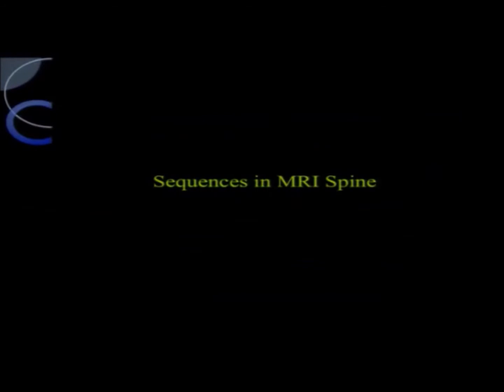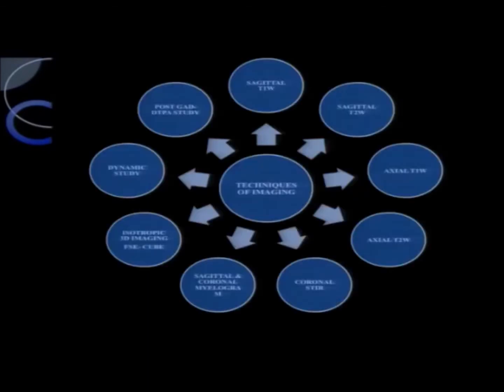The basic consensus on what should be done when we are doing MR imaging in terms of sequences is sagittal T1, sagittal T2, axial T1 and T2, coronal STIR because you don't want to miss out anything else like inflammation or infection, and sagittal and coronal myelogram. Most of us have now given it up.